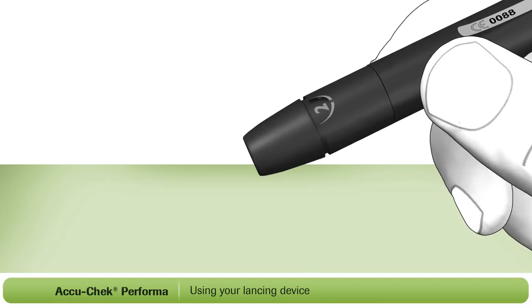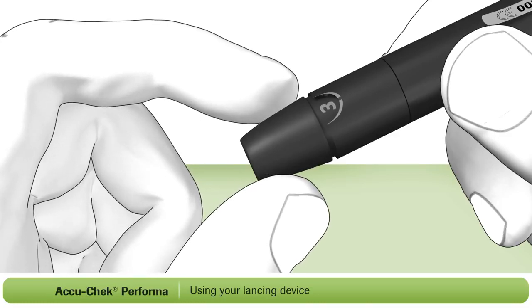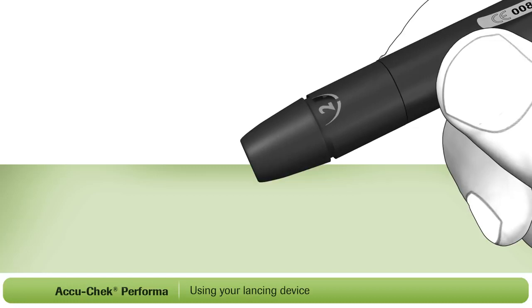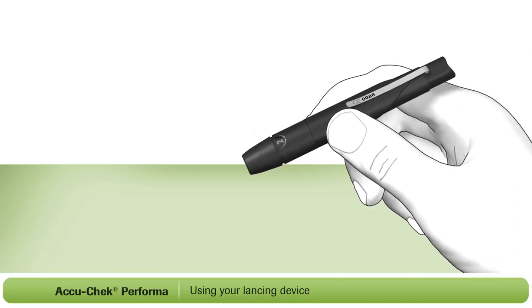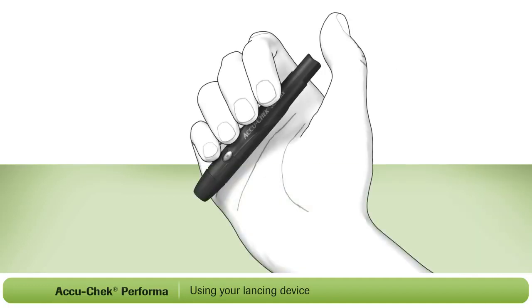The next step is to set the penetration depth to match your individual skin type. By turning the dial on the cap, you can select the depth of the lancet. Set the dial to 2 to begin with. You may need to adjust the setting a couple of times until you find the right level for your skin type. To use the lancing device, you first need to prime it.